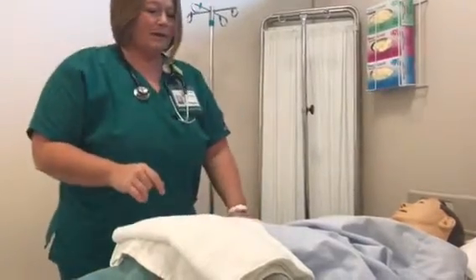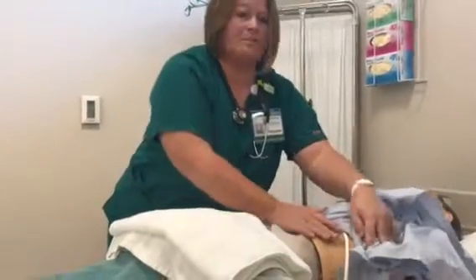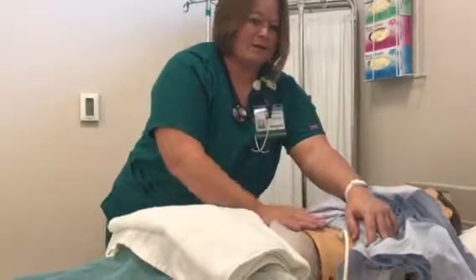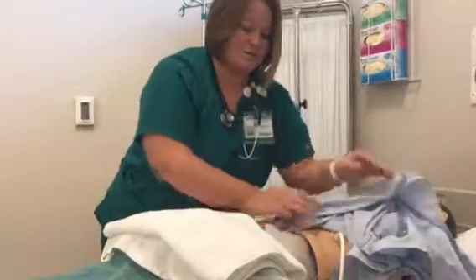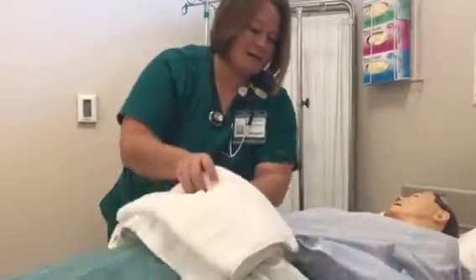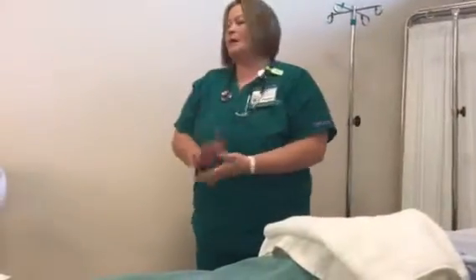Now you want to make note that if you have a patient that has an enteral feeding tube that's inserted through the abdominal wall, that you're assessing it for any skin breakdown, irritation, or drainage. His looks really good, so that's good. So, Mr. Pearson, I'm just going to go wash my hands and get my supplies, okay? I'm going to go perform hand hygiene. I'm going to come back.